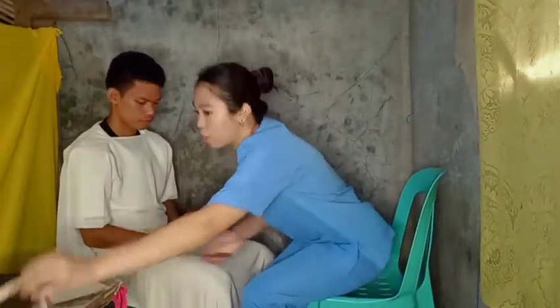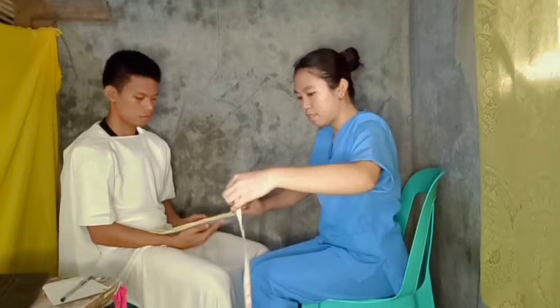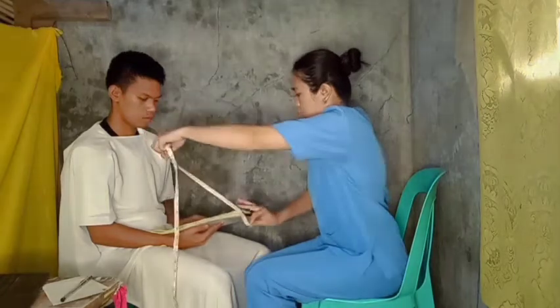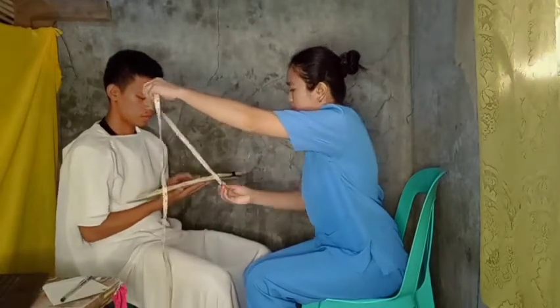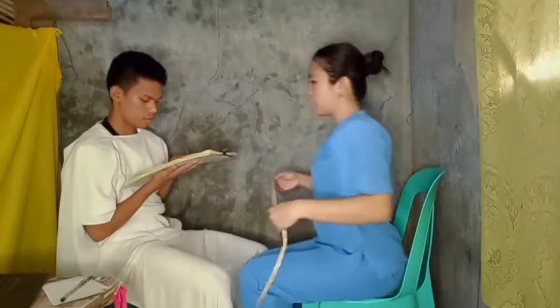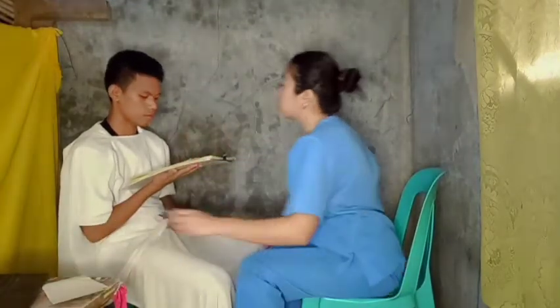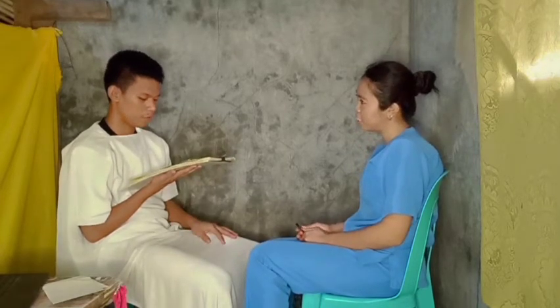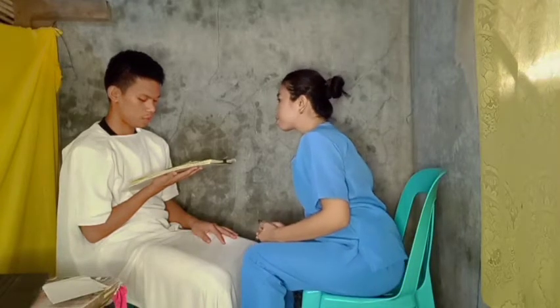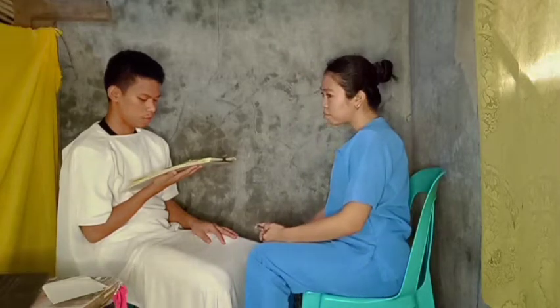Okay, so here is a measure. Can you please take that, sir? So now, sir, we are ready to perform the next step. Now, kindly read the content for me. Start. Yes, sir. 958742843 638 EW3 8745 3MW.